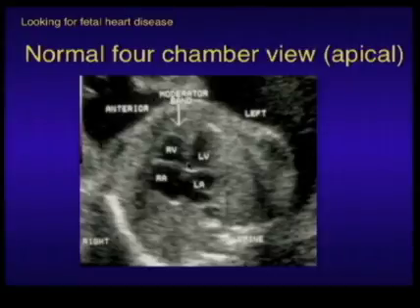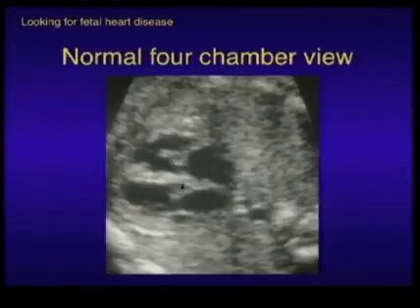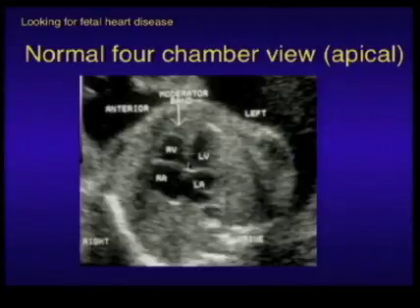The previous image showed the heart in a position where we were able to see, using axial resolution, the sides of the ventricular septum, but here it relies on lateral resolution. We just can't see it as well. Still, we can see that the chambers are about equal in size on the right and the left side, about 1/3 of the chest area occupied by the heart. All the other normal things about this are present.